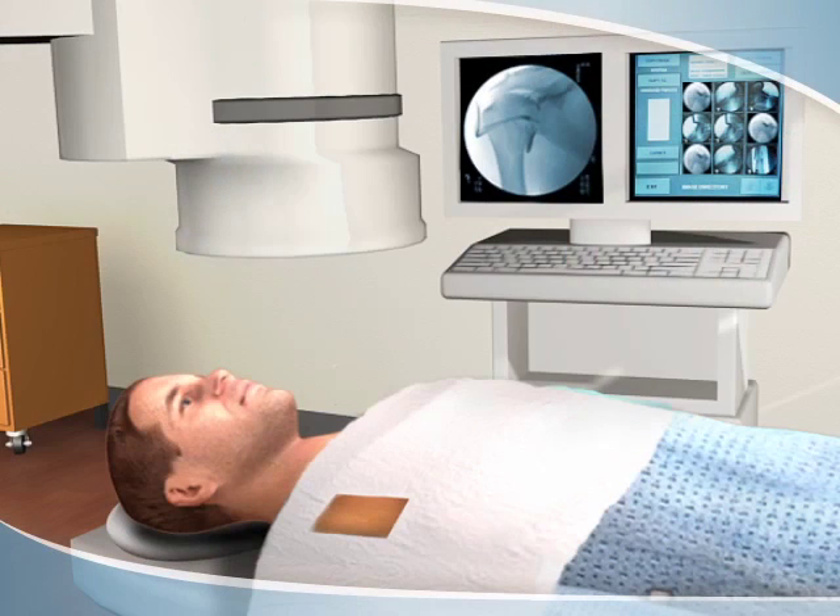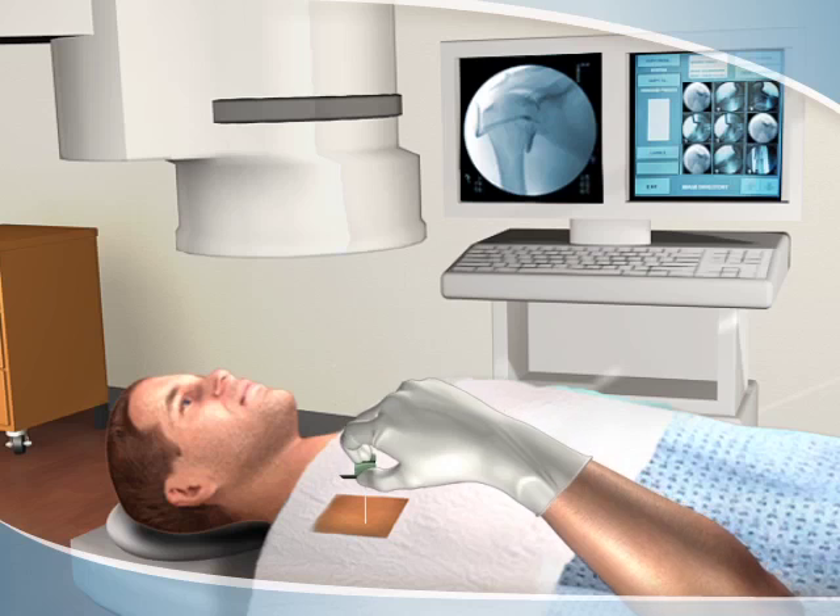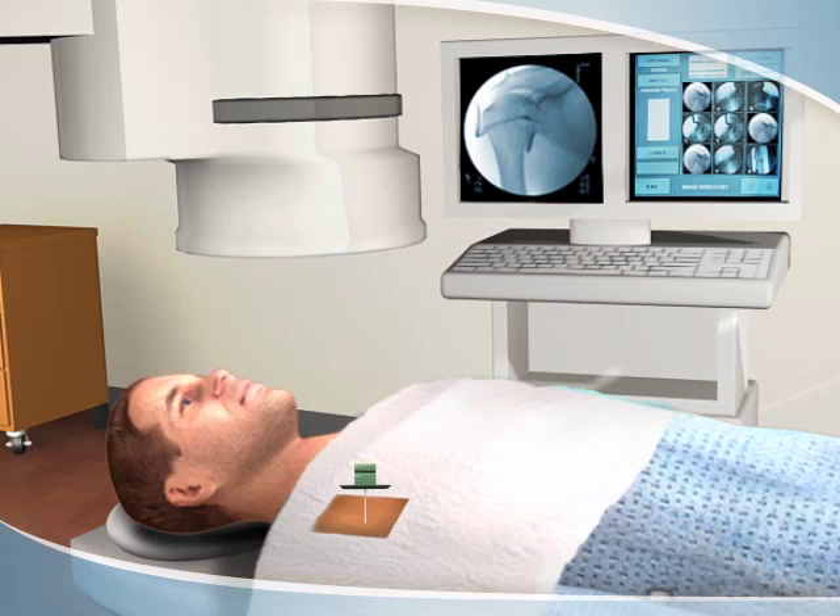Using a sterile technique, a thin needle is inserted into the joint. Safe and accurate placement is confirmed with the x-ray images.